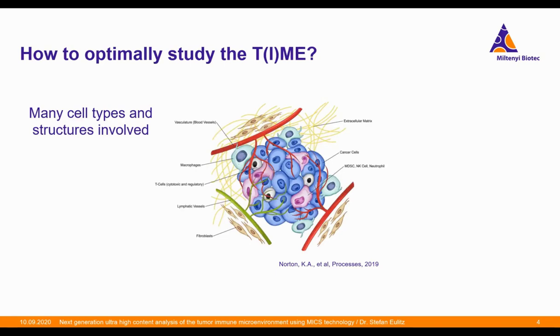Furthermore, in order to get a comprehensive understanding of the involved cells, it is wanted to analyze as many markers as possible to not miss an important characteristic of certain cells. Therefore, the number of markers should be even increased, and we have not yet addressed the markers we need to visualize the tissue architecture. So it becomes very clear that a really large number of markers is needed.